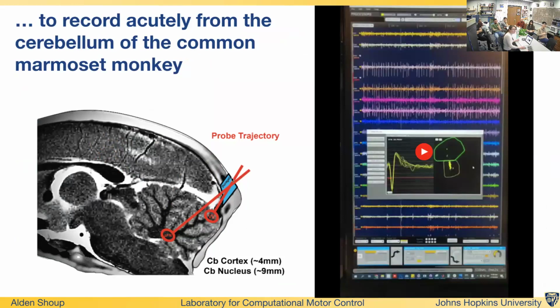picture. So this here is a layer of Duragel. It's like a two-part silicone substrate. We use this almost as a support when we're trying to penetrate into the dura because we don't do a durotomy. And so this flimsy probe has to penetrate into the dura, and this Duragel gives it a nice support to do that.